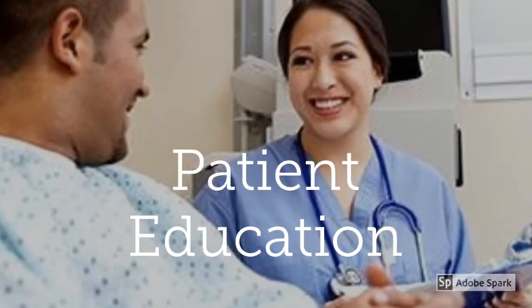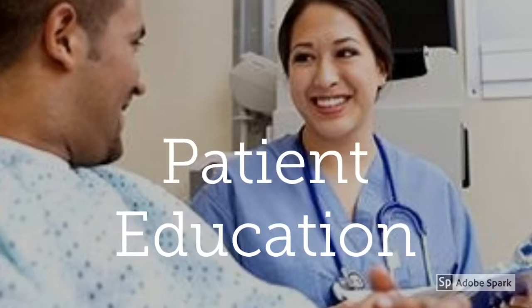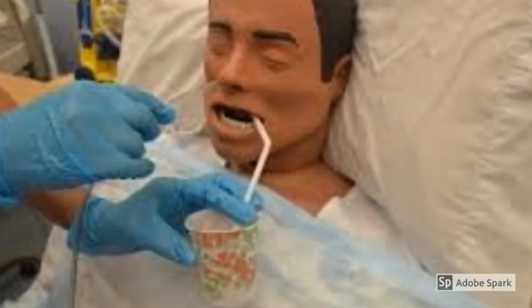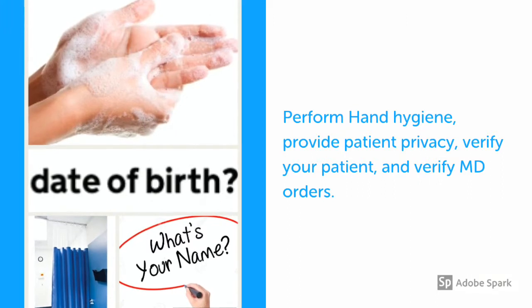Patient education is important so that our patients know what to expect during the procedure. So explain to our patients the reason for the NG tube, letting them know that it may cause discomfort, and when it's done, they will have a chest x-ray to confirm placement. Let them know that it is important they stay still, but if it becomes too much, raise a finger. Inform the patient that tucking their chin and drinking water through a straw while you are inserting the tube may help. So now we are just about ready to insert that NG tube.